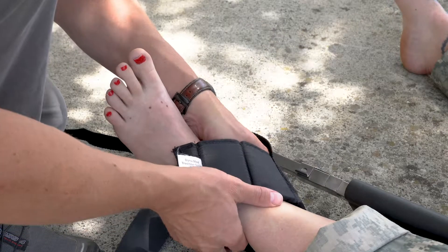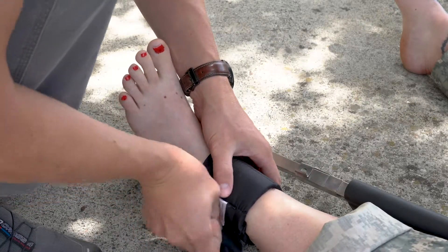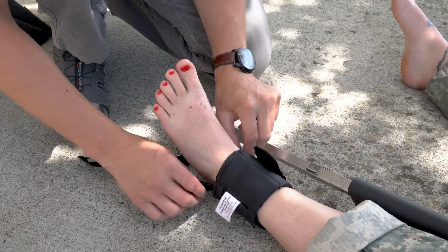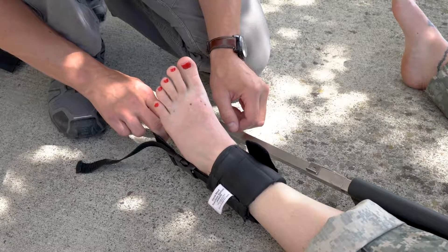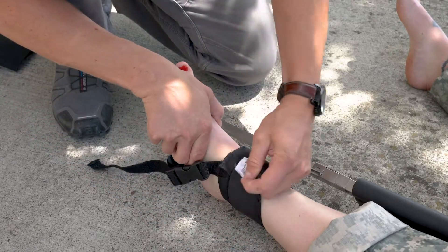To place the ankle hitch, slide it under the void behind the ankle and secure it using the Velcro. Make sure the straps of the ankle hitch are positioned evenly on either side of the patient's leg so that when mechanical traction is applied, it pulls in a neutral anatomic direction. If the straps are twisted, it can apply a twisting, displacing force to the patient's leg.